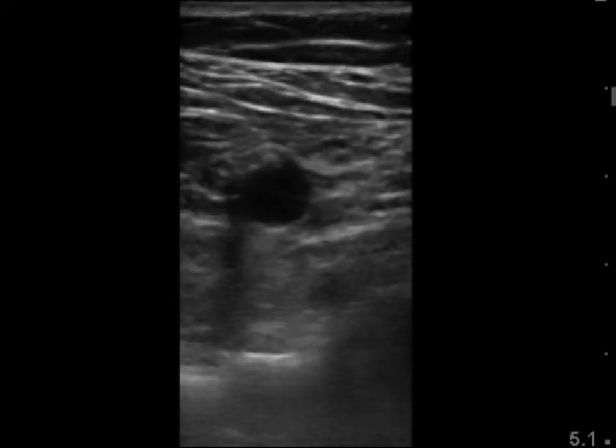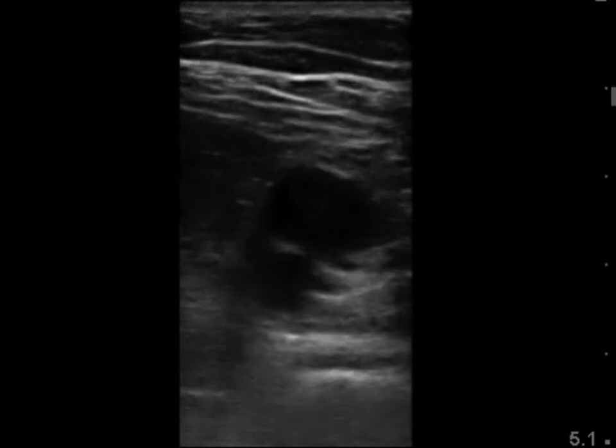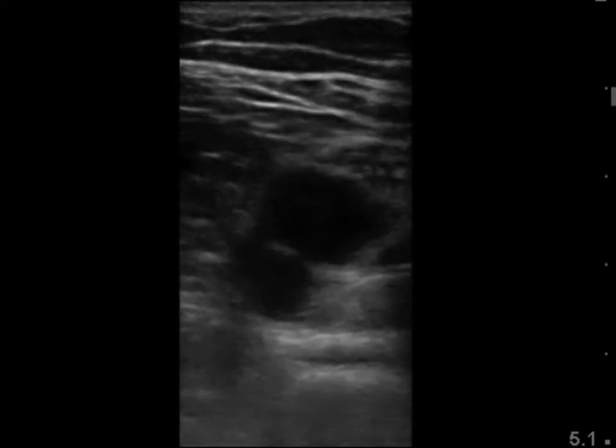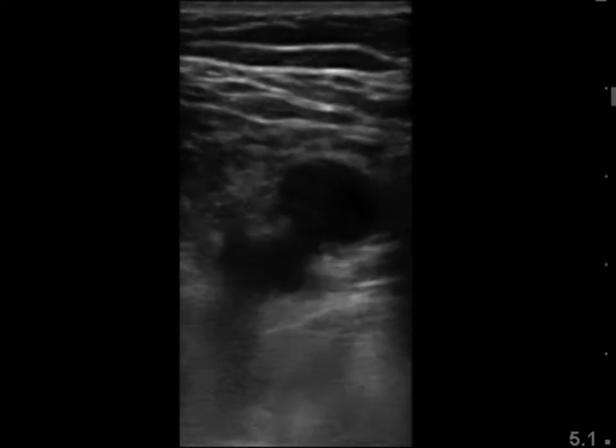Now I'm sliding proximally to it just being the one popliteal vein. Now I will tell you that I have never had an image this good again, so I had to use this one. Oftentimes when they branch, one will be quite a bit bigger than the others, or they'll dart off in different directions quite quickly. So don't be surprised if it doesn't look like this perfect four-leaf clover.